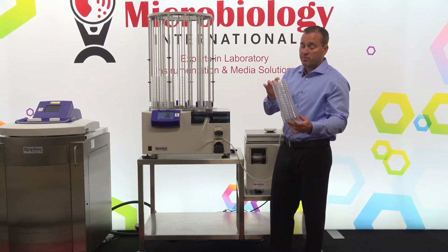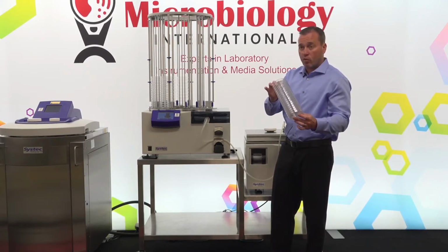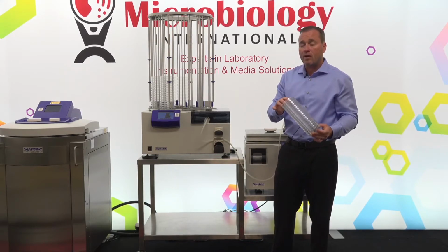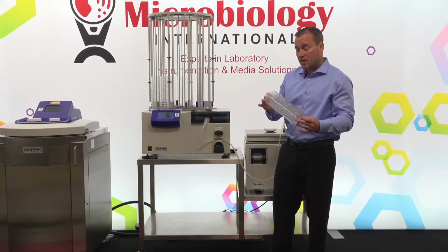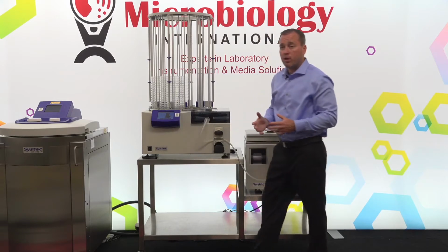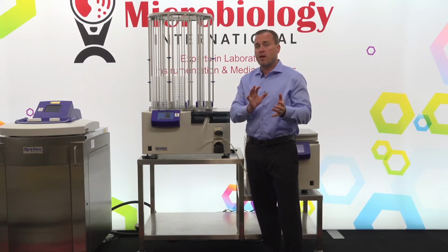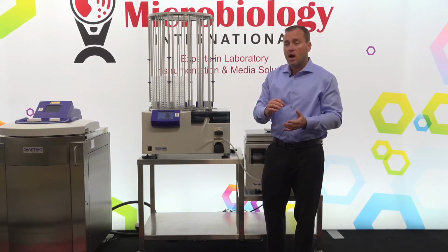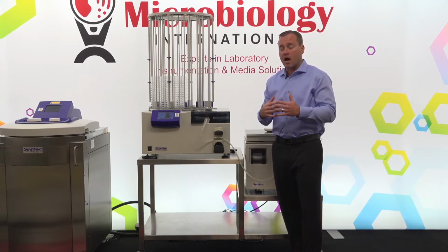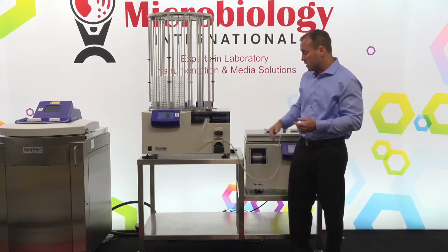Each of these plates from different manufacturers all have a bit of different sizes, so we would need to program that for the specific plate type. Now, if you use multiple plate types, we can put those into the catalog. Just simply select the correct plate type and then move on. This system is designed for slippable plates for automation. So almost always, if you're going from a manual process, you may be using a stacking ring plate. Just one catalog number different is most likely the exact same plate, but then it is designed for slippable automation so the plates can move through robotics, as we see here.